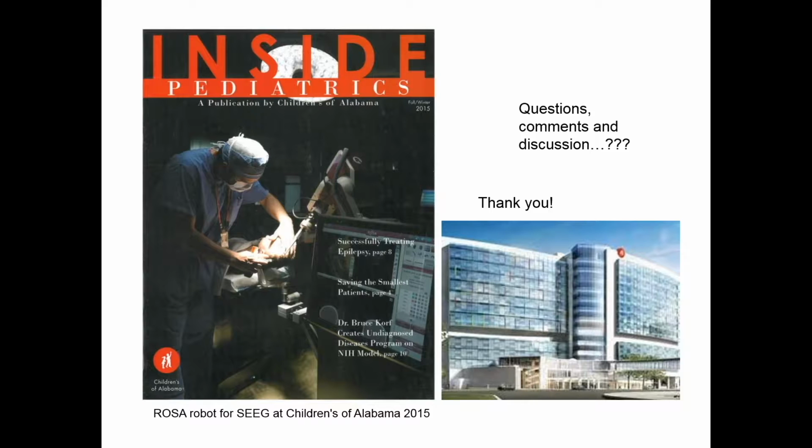That's not to say grid is better. It's just that we did them 5 years ago with a grid, or we did them 3 years ago with a grid. And each of the kids has been like, wow, this is much easier, much better tolerated than the grid. I'm not ready to throw grids out. I think in the real world, it's like so many things: to really use the tools in the tool shed carefully, each modality has its applications.